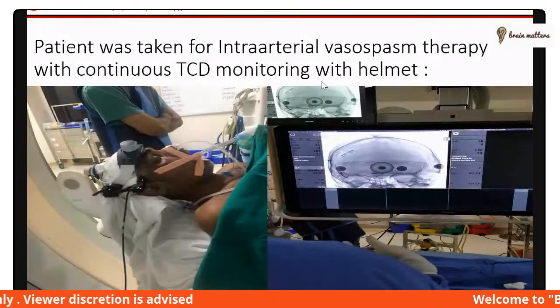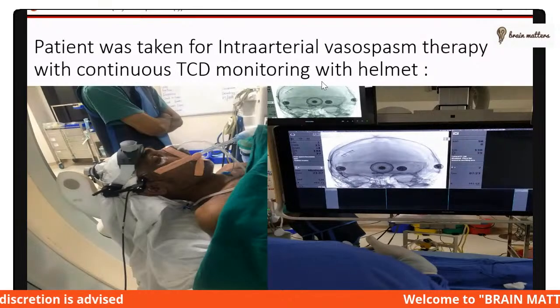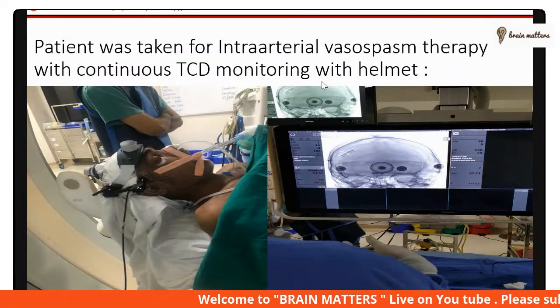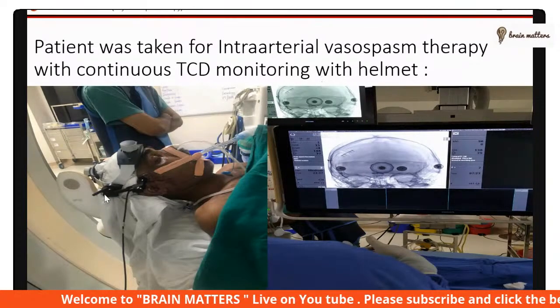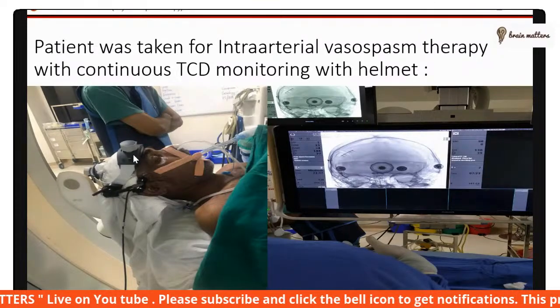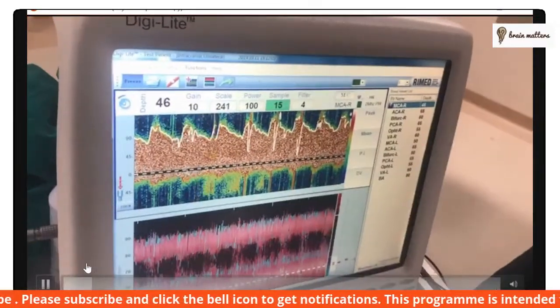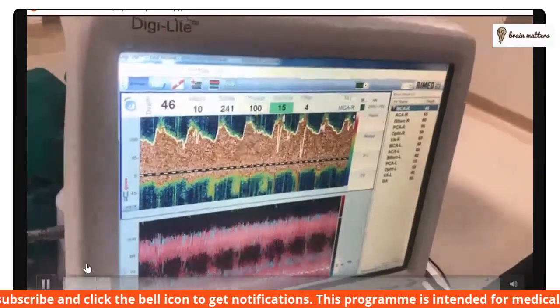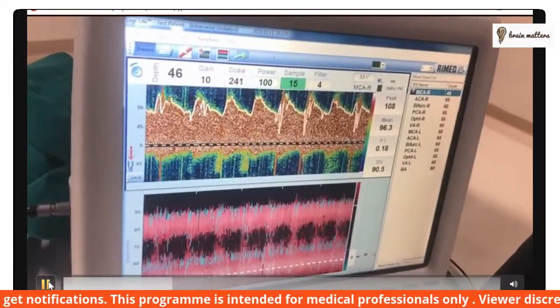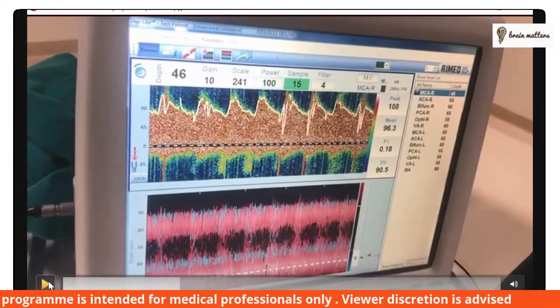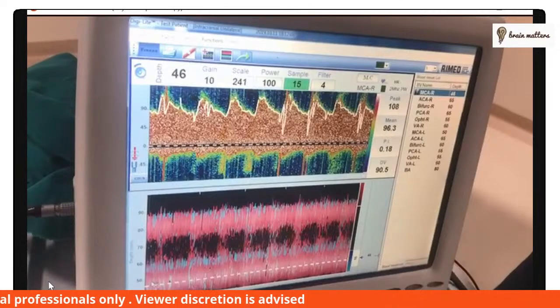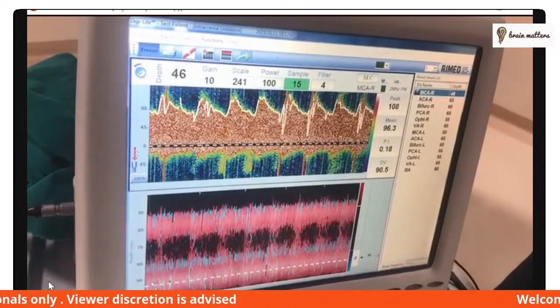The patient was taken up for intra-arterial vasospasm therapy with continuous TCD monitoring using a TCD helmet. This video shows the TCD monitoring of the patient, which demonstrated increased mean and peak velocities.